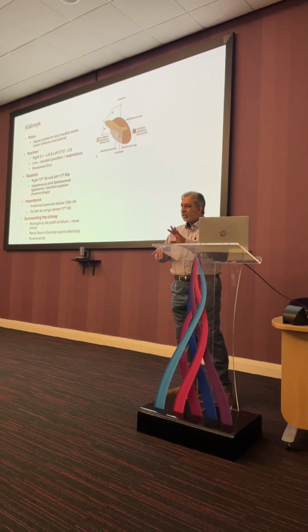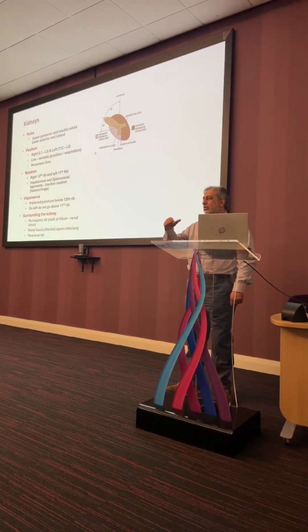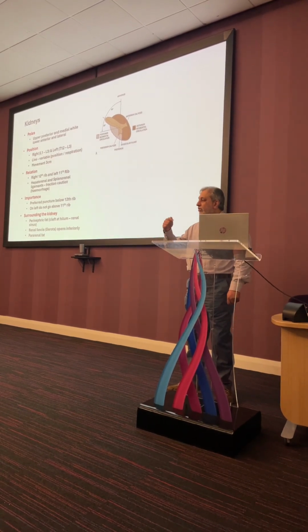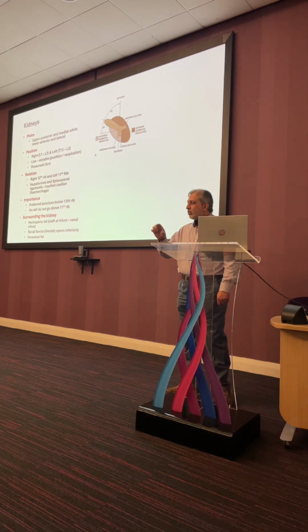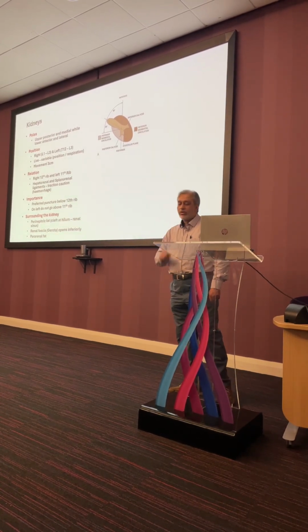Normally there is about 3 centimeters of movement up and down, and you will appreciate that when you are doing the endoscopy. So sometimes it may become challenging to do the ureteroscopy.